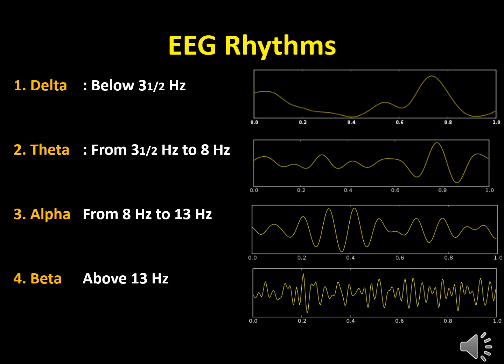Most humans seem to develop EEG patterns in the alpha range when they are relaxed with their eyes closed. This condition seems to represent the natural frequency of the brain. As soon as the person becomes alert or begins thinking, the alpha rhythm disappears and is replaced with a desynchronized pattern, generally in the beta range.